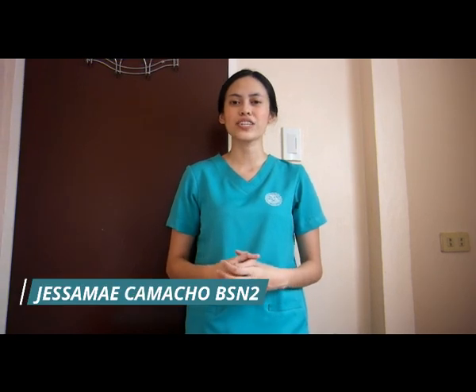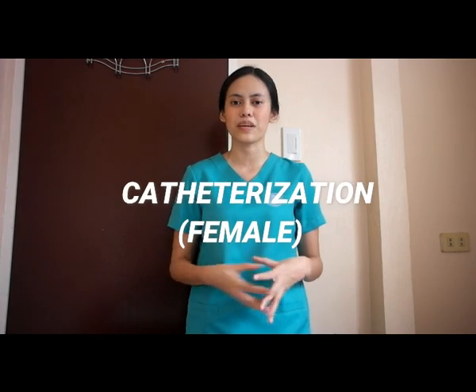Camacho, a second-year nursing student, and in this video, I'll be demonstrating the catheterization for female patients. So first things first, we have the assessment.